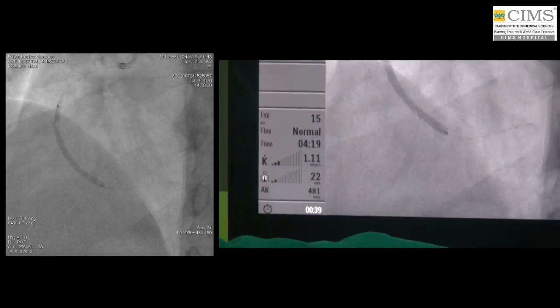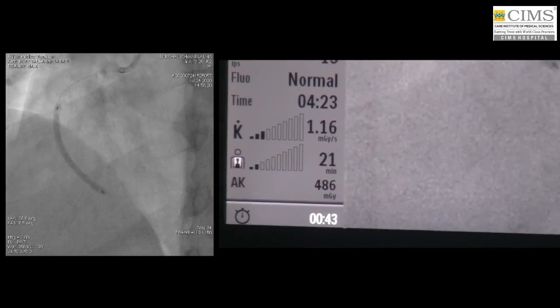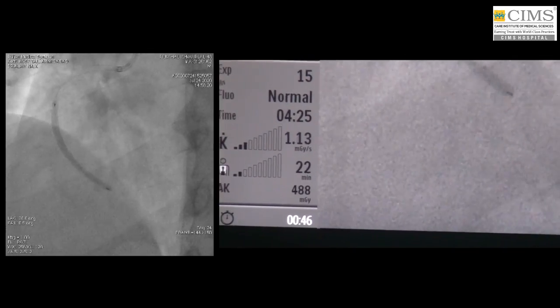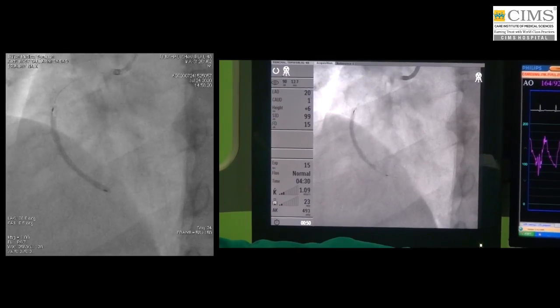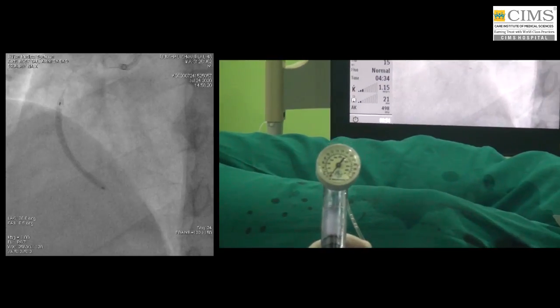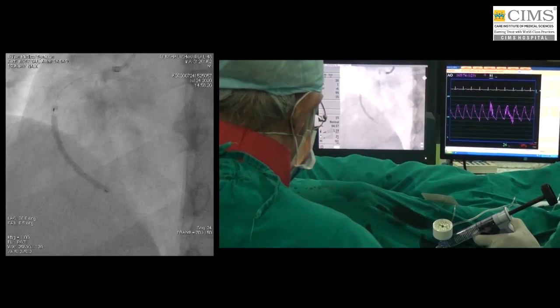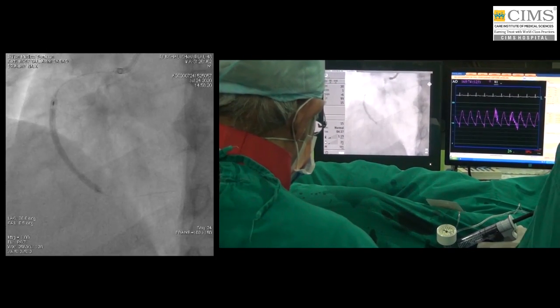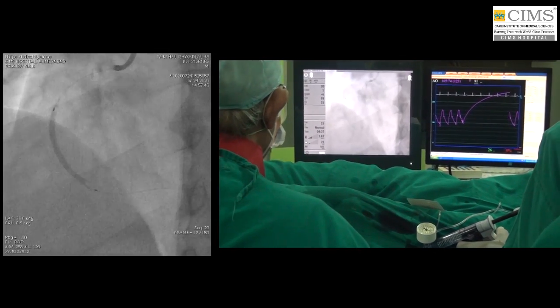Okay. Abbott's bioabsorbable stents really led us to incremental knowledge on stent placement, which we did not have for almost, I would say, a decade and a half. And what we learned is that longer inflations are indeed favorable, and we do not have to go to extremely high pressure unless absolutely required in very few cases.